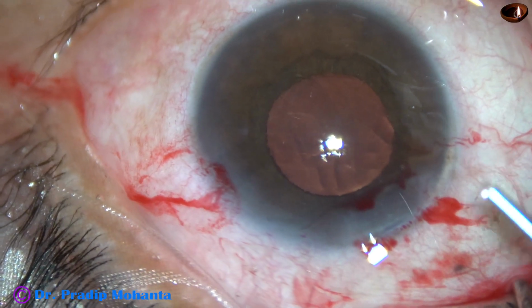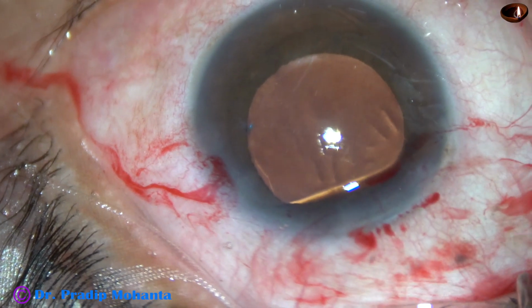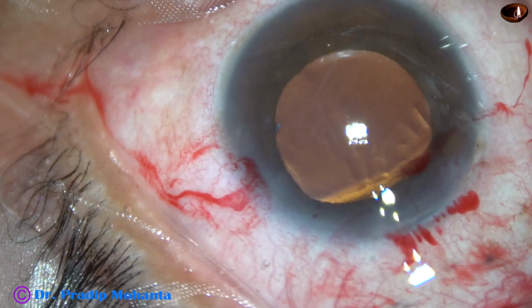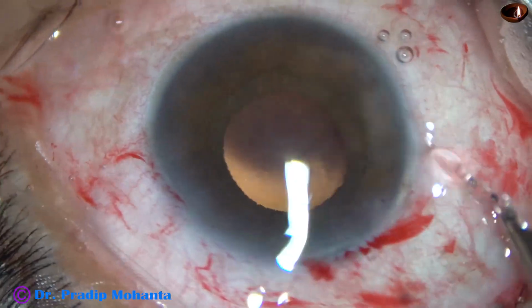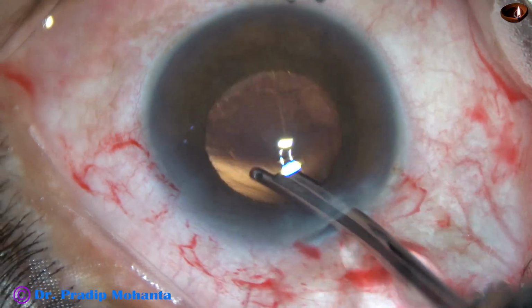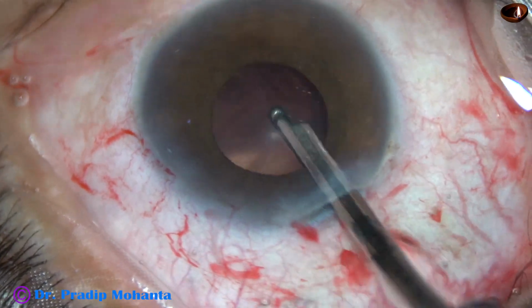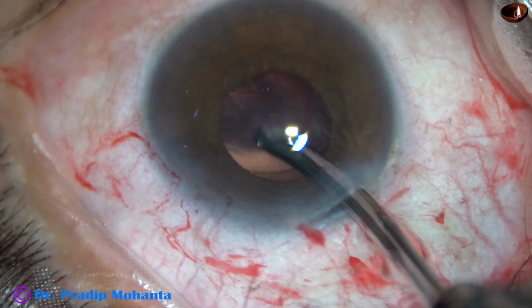And now some more visco. And now is the time to clean the visco. The 23G Simcoe is used to clean most of the visco. At this time you can see the pupil has become quite small.